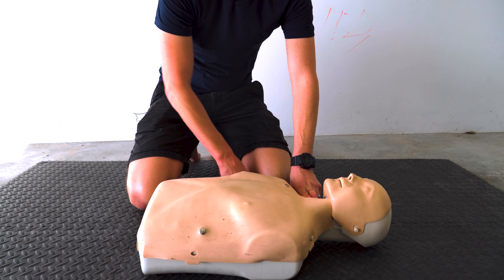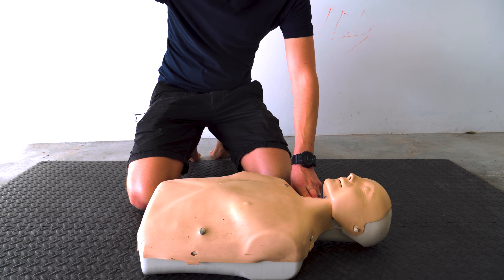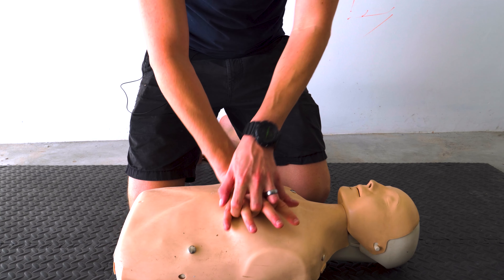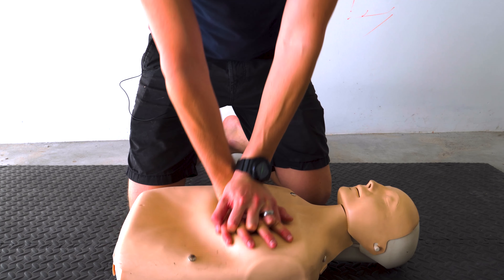Can I please get help? Can you call 112? And we're going to start CPR — lower half of the sternum, between the nipple line.